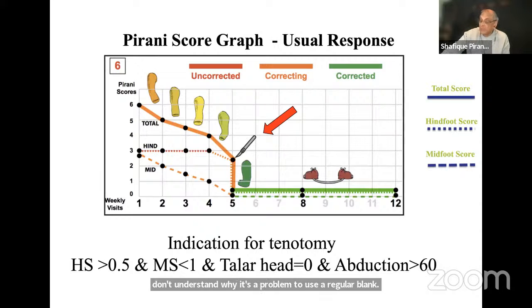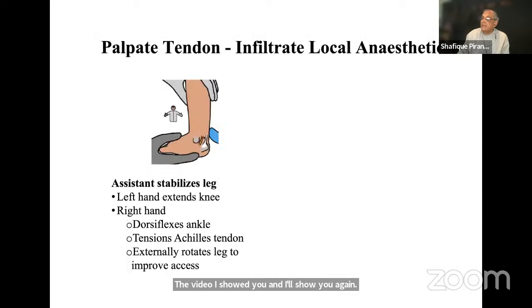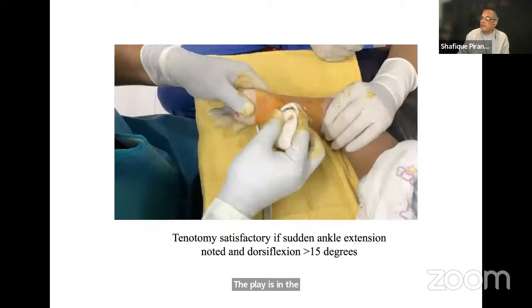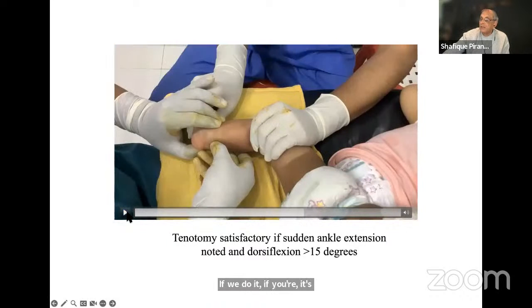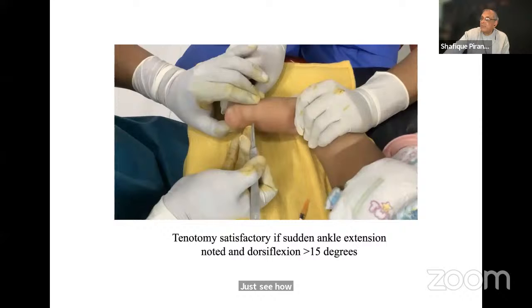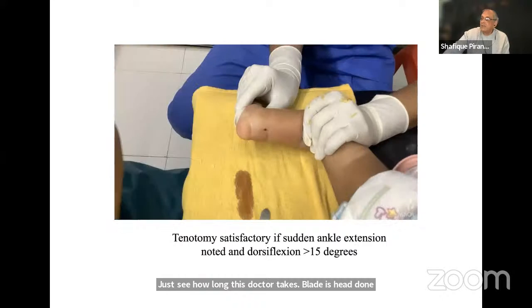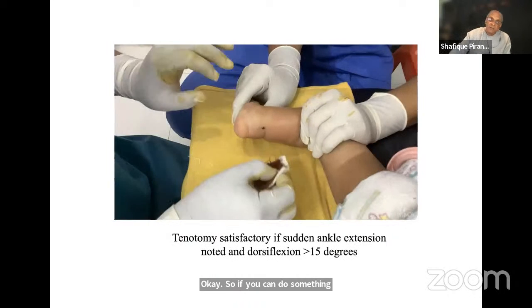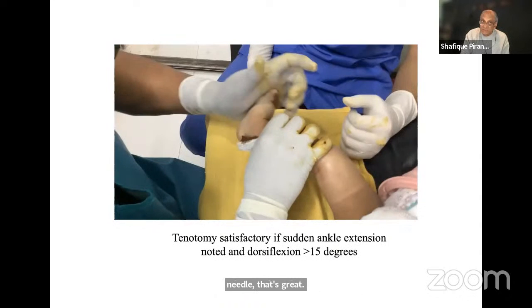The video I showed you, and I'll show you again, the blade is in for literally a couple of seconds. Just see how long this doctor takes. Blade is in, turn, done, out. Okay. So if you can do something that quick with an 18 gauge needle, that's great. But you need to have a very clear explanation as to why, what part of the needle is doing what.